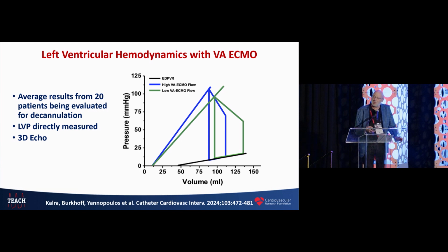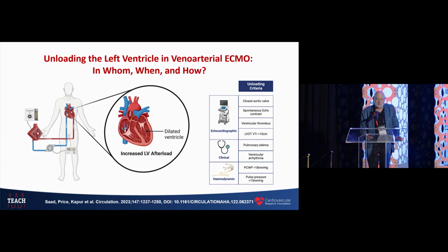This is an interesting cohort. This is a cohort that has survived ECMO and is undergoing a weaning protocol. And I think I see other people in the audience here who also believe that ECMO does not load the ventricle in a majority of cases. So we don't really know, and there's certainly a lot of controversy.